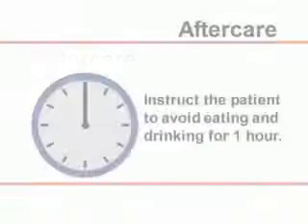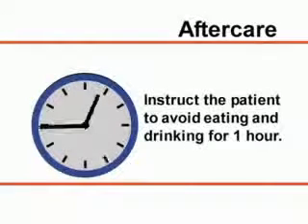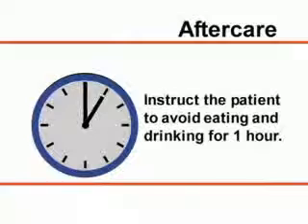Aftercare following nasolaryngoscopy is minimal. The only instruction given to the patient is to avoid eating and drinking for 1 hour to prevent aspiration that could be potentially caused by reduced laryngopharyngeal sensation. This procedure is generally painless, and therefore no post-procedure analgesia is required.